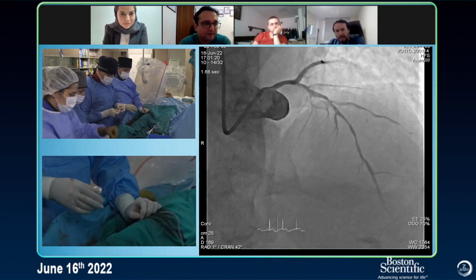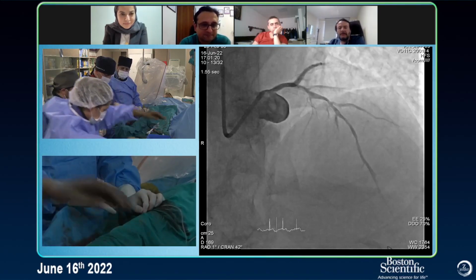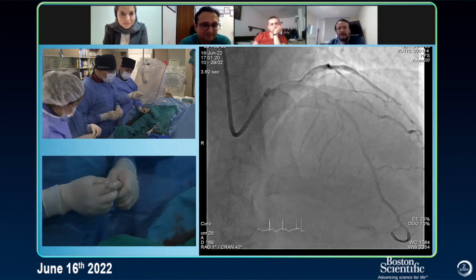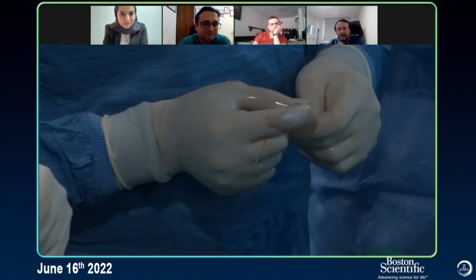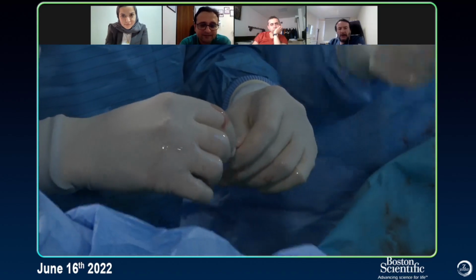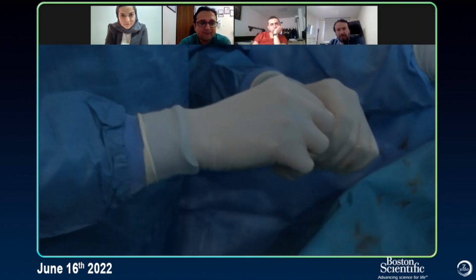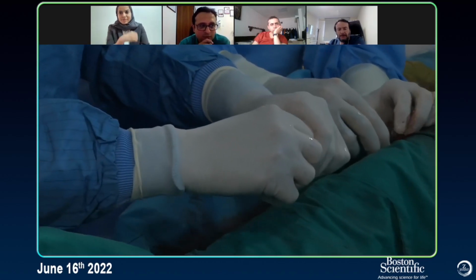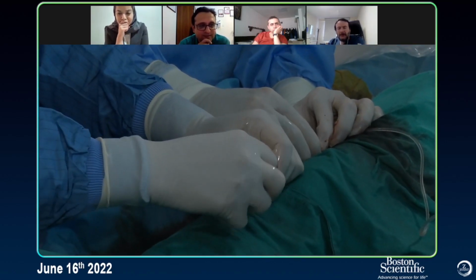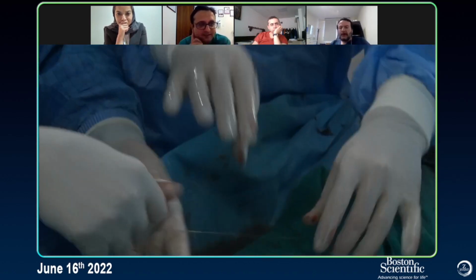No, I don't like it. I have no reason to do it. This is easily kinked. So I think we have to remove this as soon as possible. Esat, what do you think? I have seen you working. We always work with a workhorse wire side by side and use it rather than taking this out. This wire helps you in loads of other ways by just staying there.